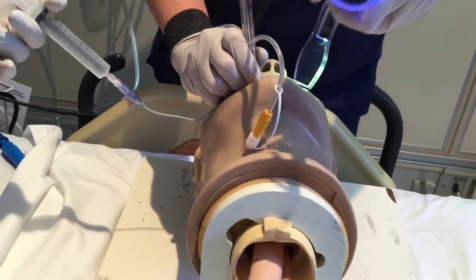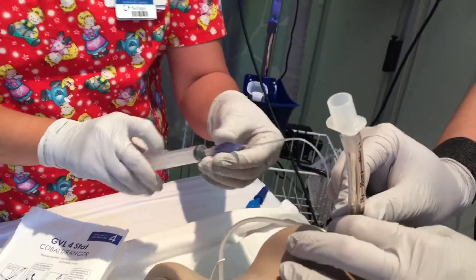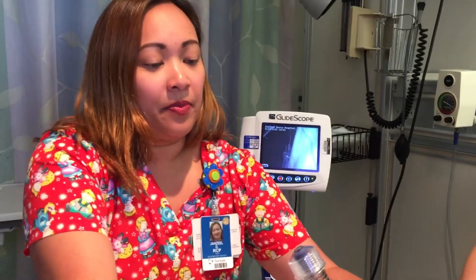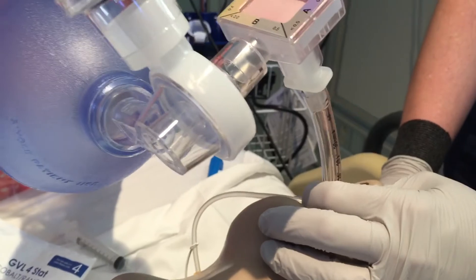Now when he has reached good placement, he will remove the GlideScope and I will remove the stylet and inflate the cuff. The doctor will hold it, and of course we will make sure of the proper securement of the tube by checking end-tidal CO2, misting on the tube, and of course auscultation for bilateral breath sounds.